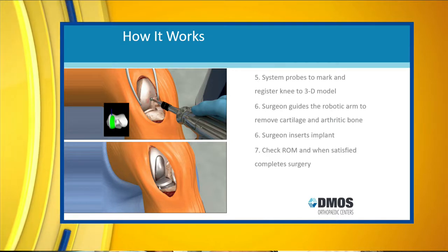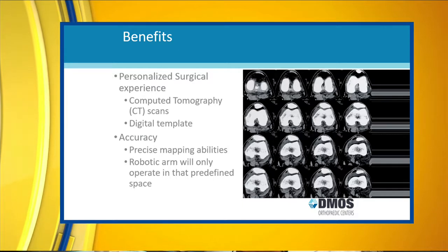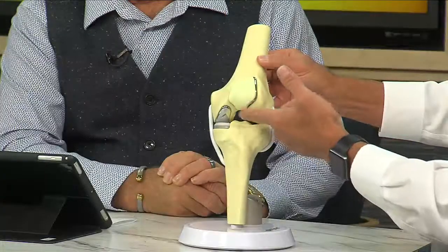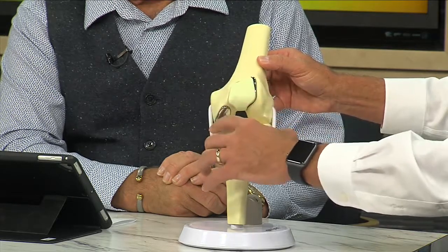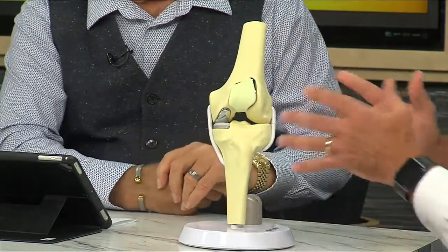Yes, so prior to the surgery, in this case we're talking about partial knee replacement. We use the robot to do partial knee replacement. And just to clarify, partial knee replacement as opposed to total knee replacement. In a total knee replacement, we're putting a new surface over the entire surface of the knee joint, the front or the kneecap part, the medial side or inner side, and then the lateral side or outer side. That's the whole thing. In a total knee replacement, you would get a surface on all of those parts.